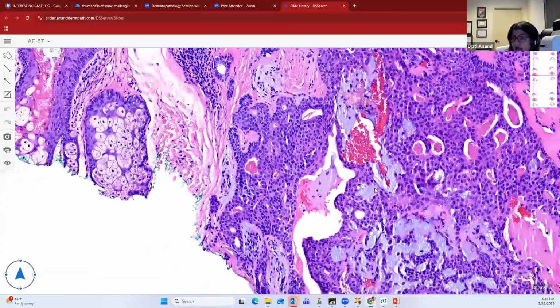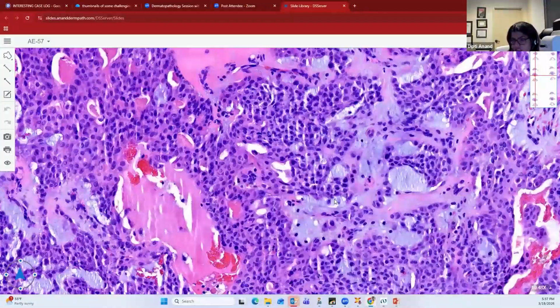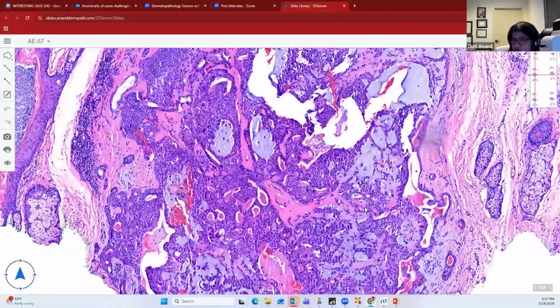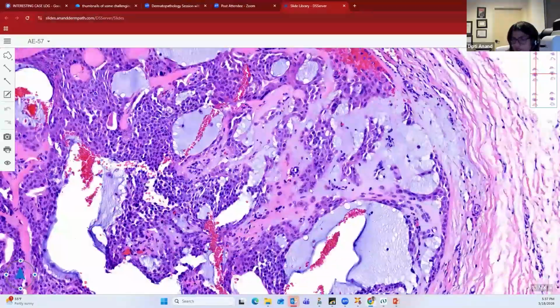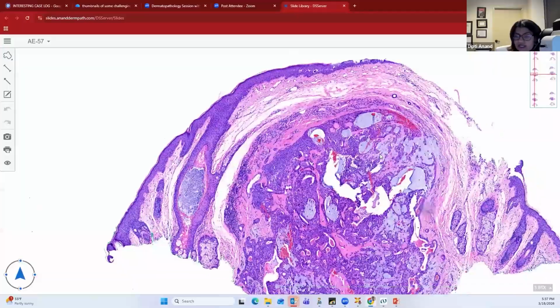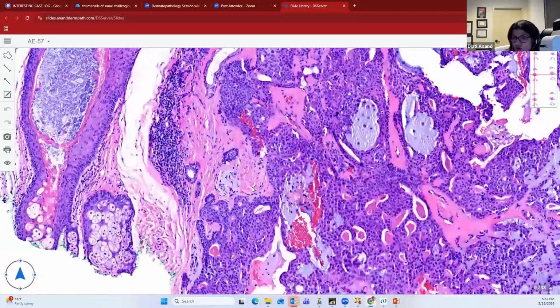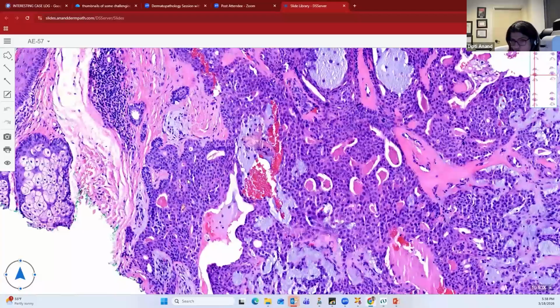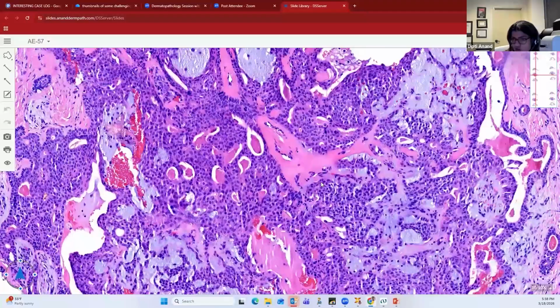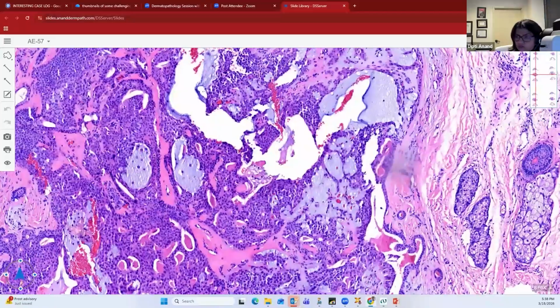This is also an apocrine/eccrine tumor, so you can have apocrine cells within the lesion. But nicely, if you see the nice chondromyxoid, the pink stroma, you know that you're dealing with the chondroid syringoma. These tumors often are in the deep dermis and the fat, and they clinically come in as cysts. So that's the location of the tumor. So you can see the nice chondromyxoid stroma. So that is your chondroid syringoma or a pleomorphic adenoma or benign mixed tumor of the skin.